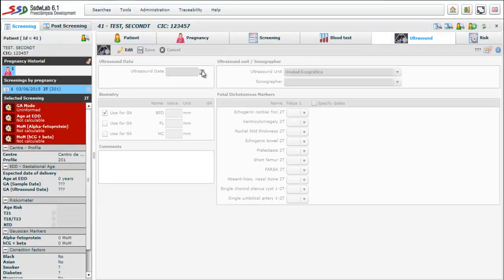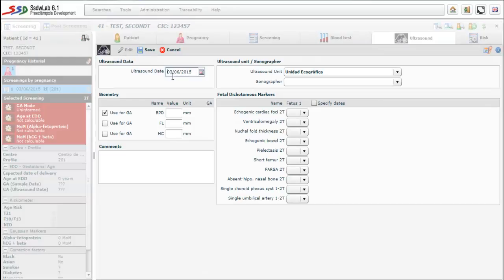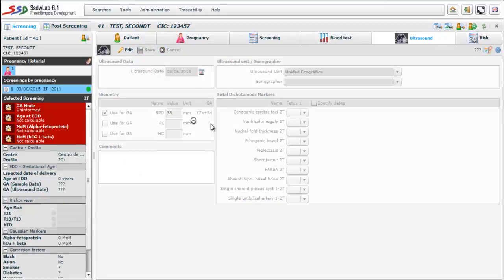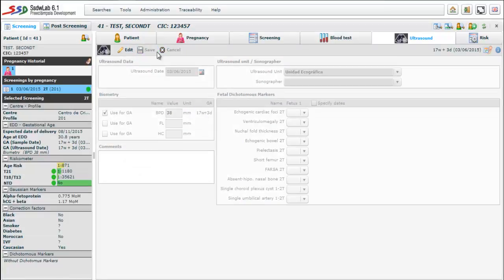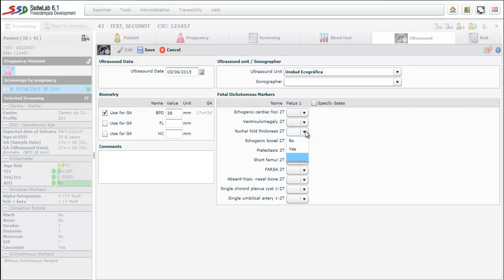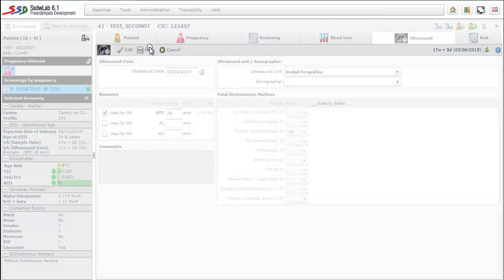The following tab is ultrasound folder. We introduce the date of the ultrasound. Then in biometric sector we mark use this to calculate gestational age and we introduce the value of BPD. We can detect how the weeks and days of gestational age are calculated. We can observe that there is a section called fetal dichotomous markers where there are several second trimester dichotomous markers such as echogenic cardiac foci, ventriculomegaly or nuchal fold thickness, that in case that the value is yes, the risk increases.